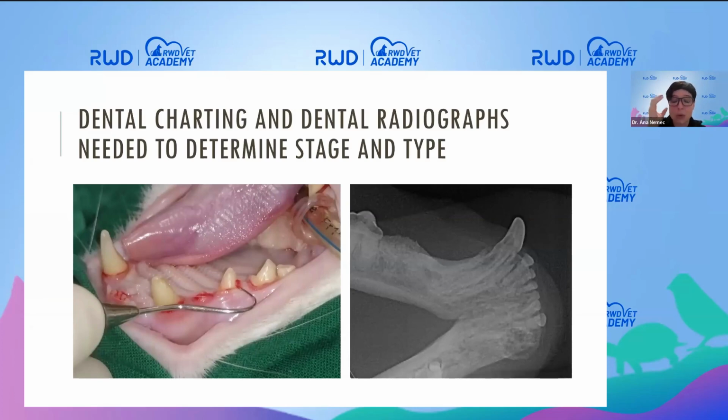So it does require a bit of practice and a bit of confidence to find the tooth resorption lesions, especially very early lesions. But using a dental explorer is what we need to do at minimum to look at the lesions that are exposed to the oral cavity. And then if the lesion is exposed to the oral cavity, if we see something clinically, treatment is needed.